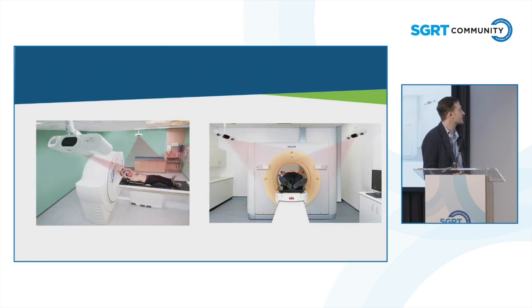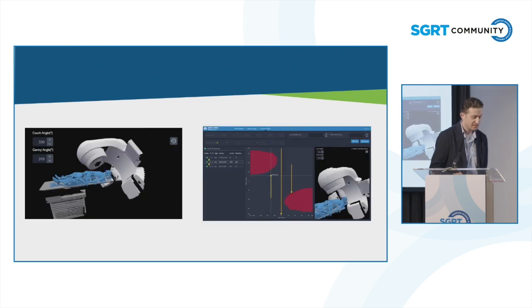So that's how it looks. That's not our CT room. Ours are being installed at the moment, but you've seen them in other slides. Again, this is the virtual space of the MapRT setup, and the other image here is what you would see with your post-plan collision test.